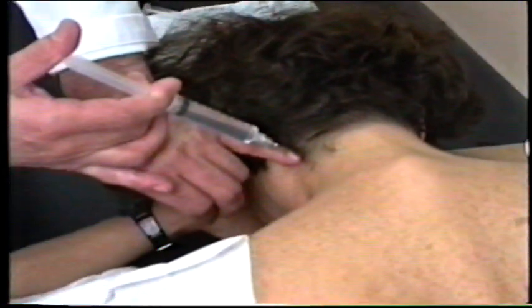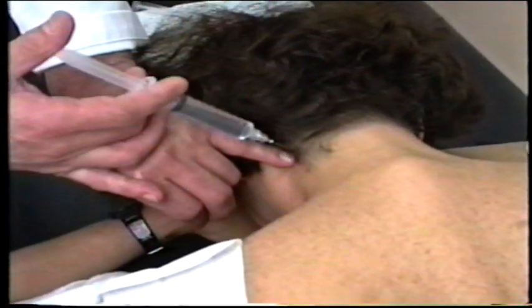Always keep either thumb or any comfortable finger on the transverse process as your landmark. This is the one, right? Mm-hmm. This is the one. Oh, yes. This is the pain. Uh-huh.